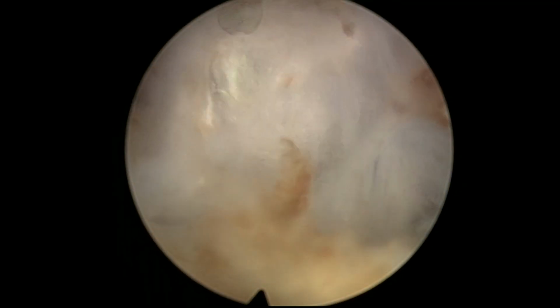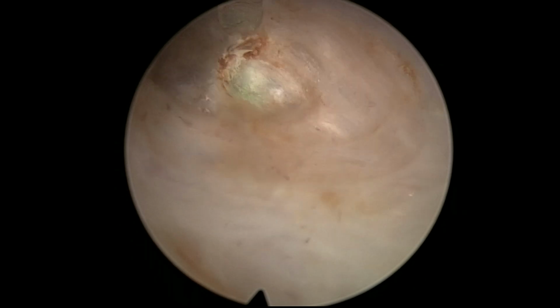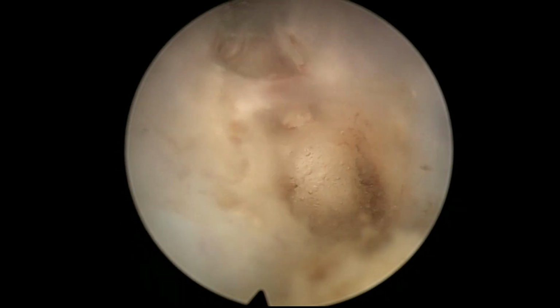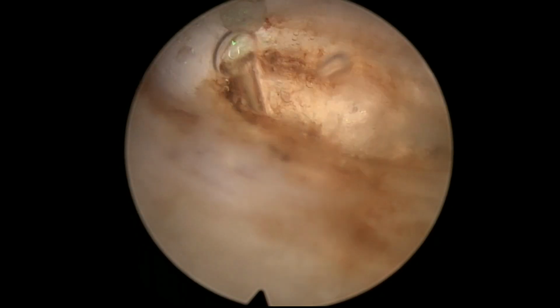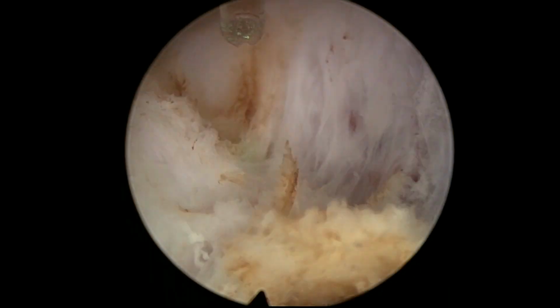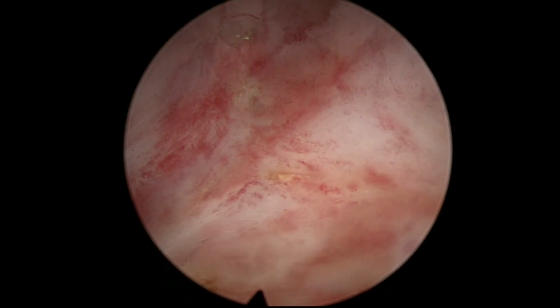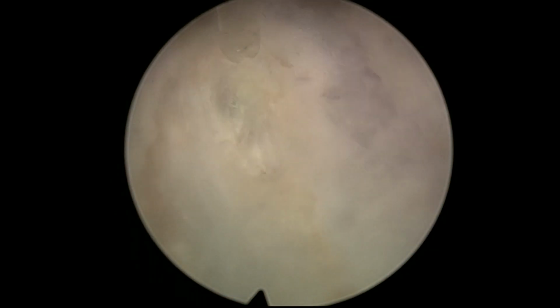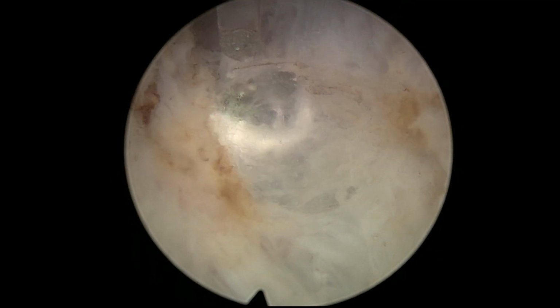So the first impressions I got with this laser was, one of them was the hemostasis is very good. Maybe the longer pulse has a lot to do with that. Maybe the tissue is a little bit more affected by the energy effect than what I'm used to using holmium lasers.